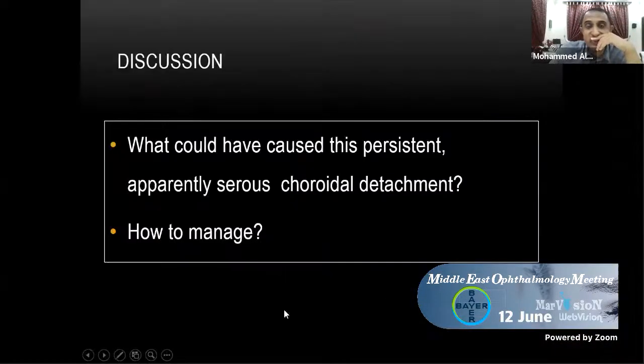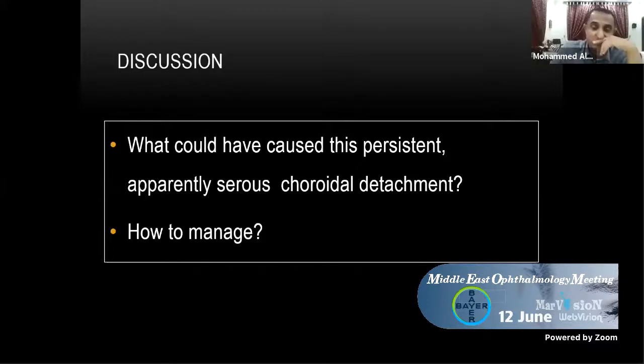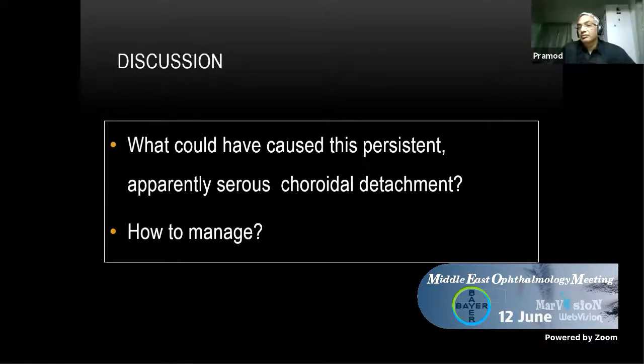There is a question: could it be buckle related? Well, he had a revision buckle, but with a buckle there's no reason for it; it should be a localized area where you have the buckle. So you have a buckle indentation, but ultrasonography clearly mentioned that there is suprachoroidal space echolucency. Of course, it's an echolucent space, so there is no hemorrhagic choroidal.